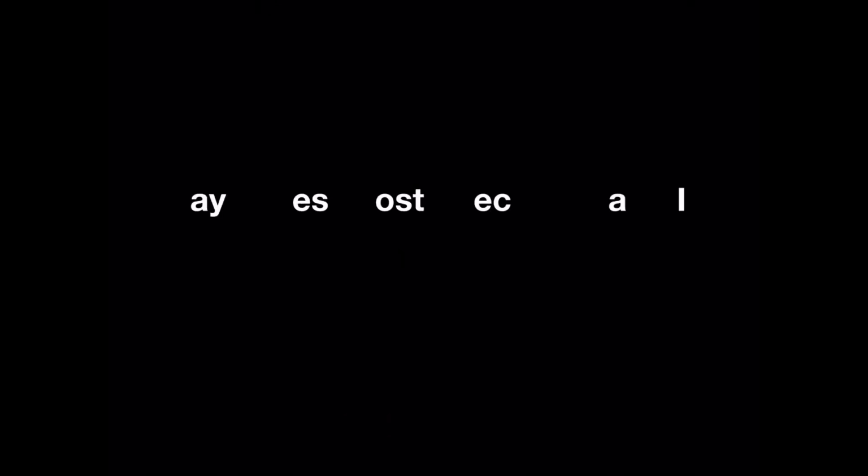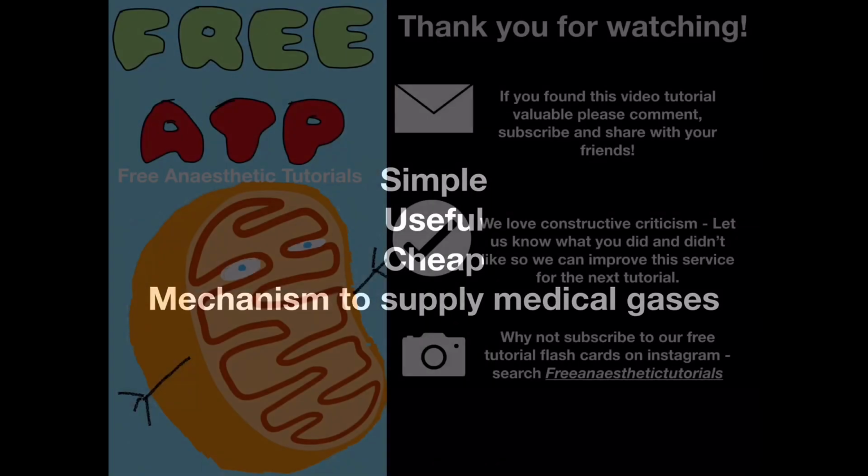Of course, some disadvantages as well. In larger demand hospitals, it may be less cost effective for supplying oxygen than a vacuum-insulated evaporator. It also has limited storage capacity compared to a vacuum-insulated evaporator. Summary: the manifold is a simple, useful, cheap mechanism to supply medical gases.